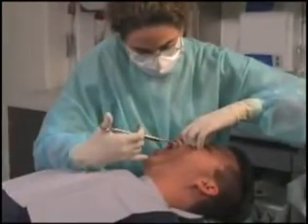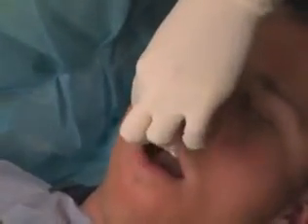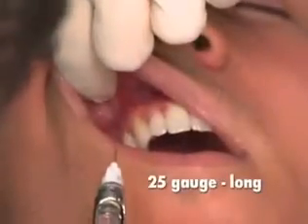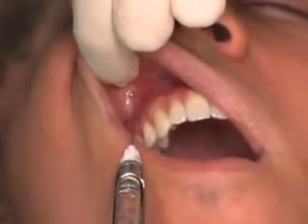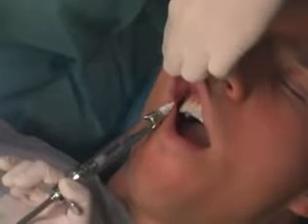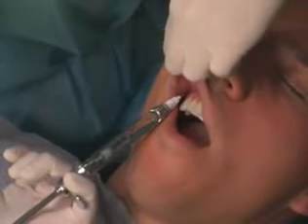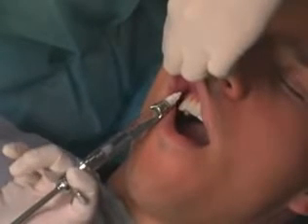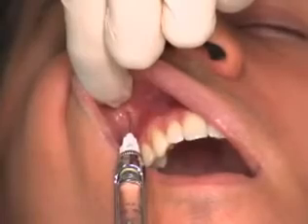The infraorbital foramen is palpated and the lip is retracted. A 25 gauge long needle is inserted into the height of the buccal fold adjacent to the maxillary first premolar. The needle is held parallel to the maxillary bone and inserted until bone is contacted at the roof of the infraorbital foramen. After two negative aspirations, one-half to two-thirds of the cartridge of local anesthetic is deposited over 30 to 40 seconds.